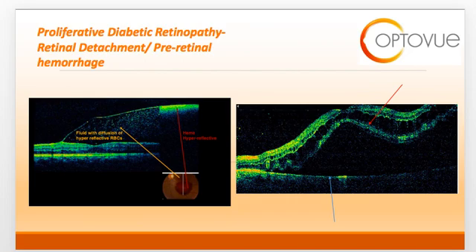Remember that neovascularization arising from the optic nerve or retina can result in the formation of pre-retinal or vitreous hemorrhage. On the left-hand side of the slide, you can see what a pre-retinal hemorrhage looks like on OCT. Recall that blood will appear hyperreflective on OCT. So you can see the pre-retinal hemorrhage appears as a pronounced area of hyperreflectivity within the vitreous. The small hyperreflective dots are blood suspended within the vitreous cavity.